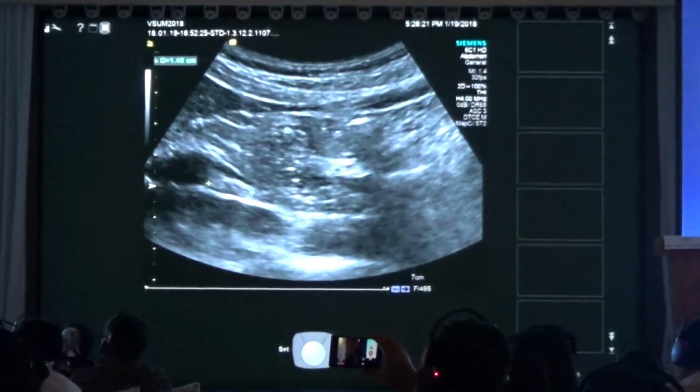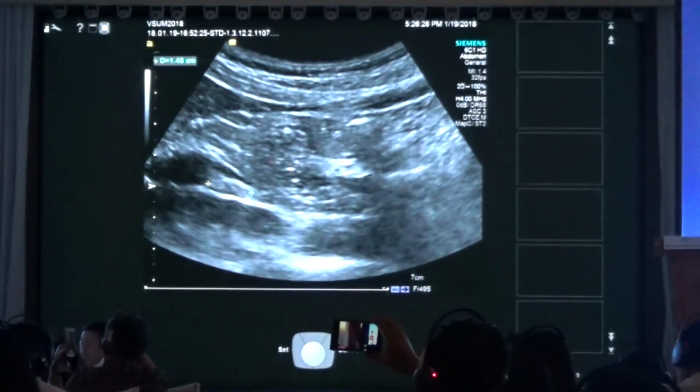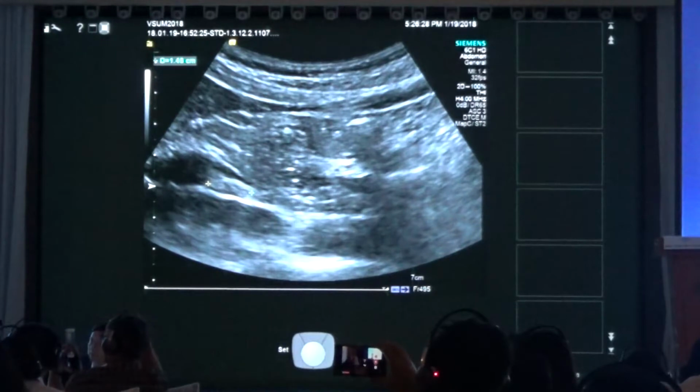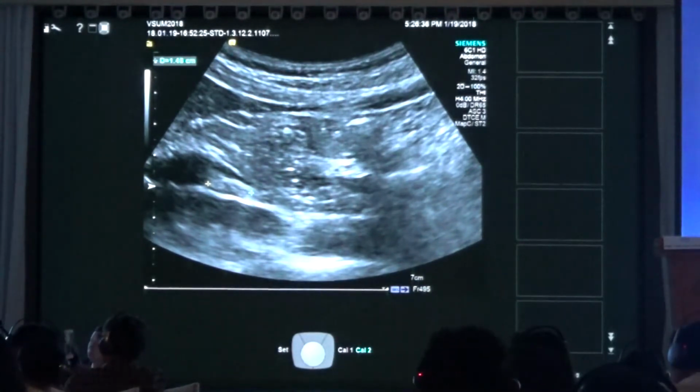After exclusion of congestive heart failure and all things which might influence the results, you start to do the liver scan, the spleen, go for ascites, go for lymph nodes, go for all that information. Position the patient, go intercostally as I've shown.